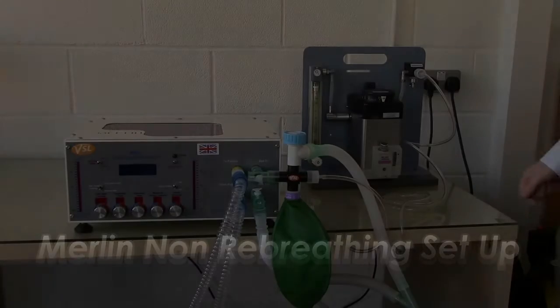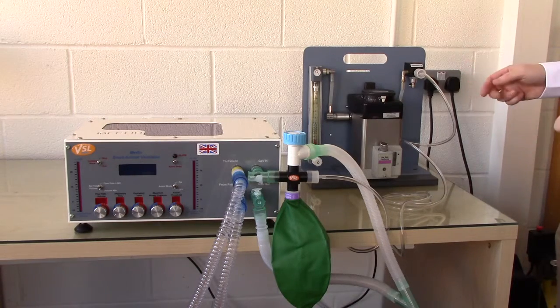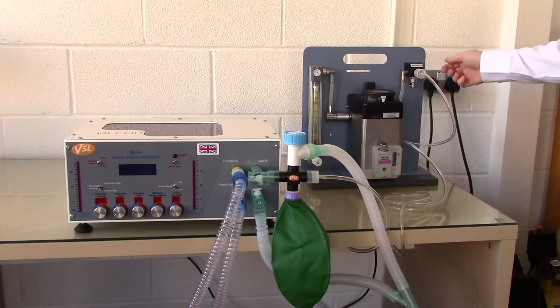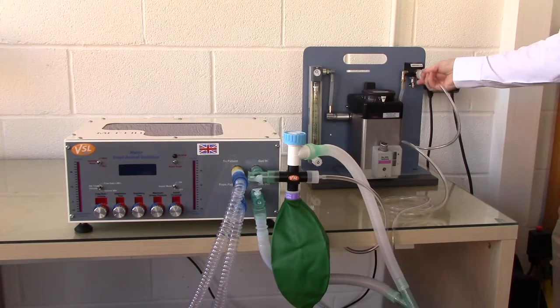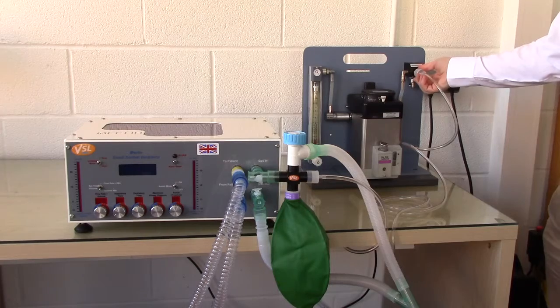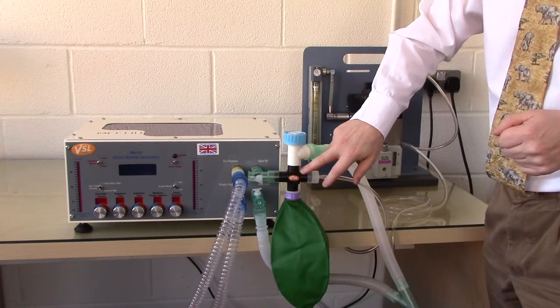This video illustrates Merlin set up in a non-rebreathing configuration. The gas supply for Merlin comes from a standard 22mm fresh gas outlet, such as shown here. This plugs into the outlet of your anesthetic machine, and flows to the black 4-way valve connector situated close to Merlin.